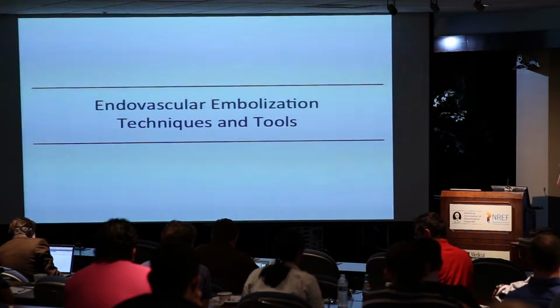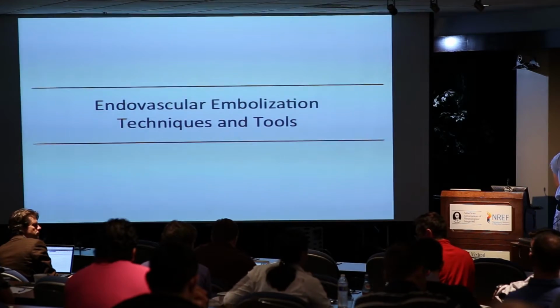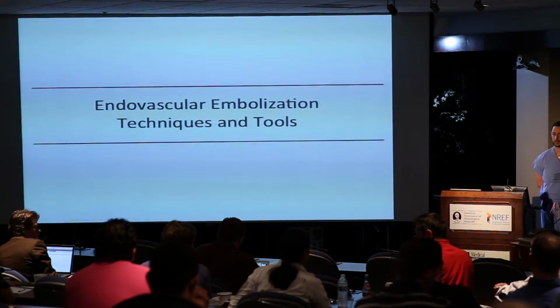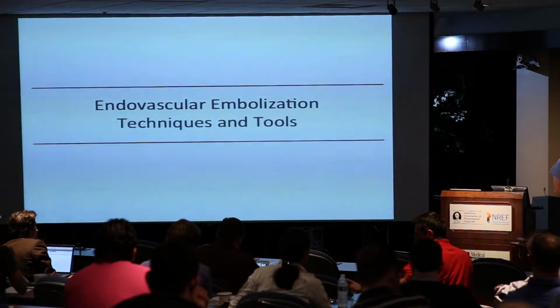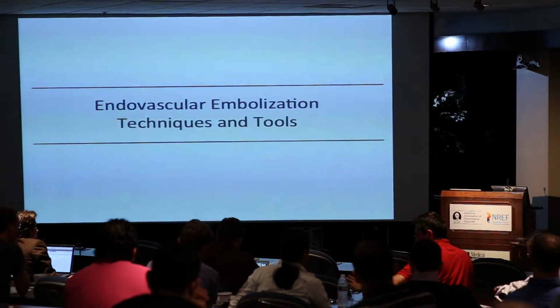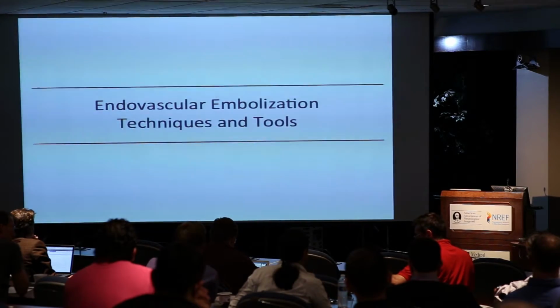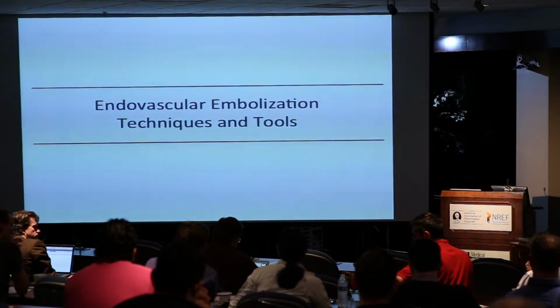So you do an embolization, followed shortly thereafter by surgical resection, post-op angio, you're done, and you're finished. And I agree that embolization, to go for a cure, I feel always very insecure with that idea. And as I said, unless the AVM is really simple, one feeder and one vein, which doesn't even need embolization most of the time, I don't think you cure.